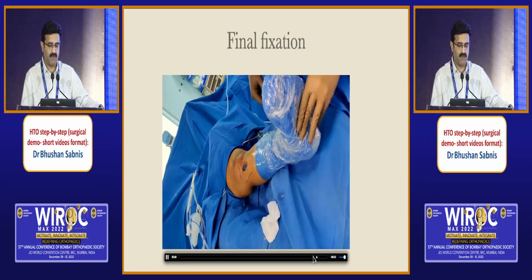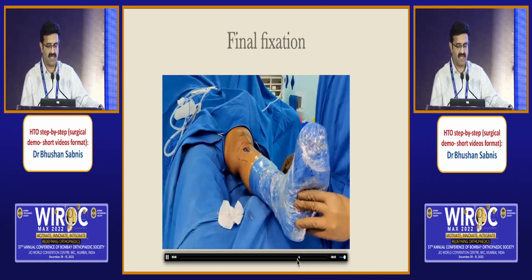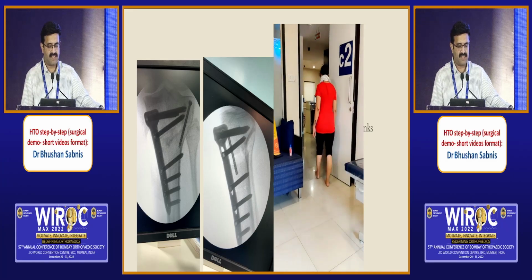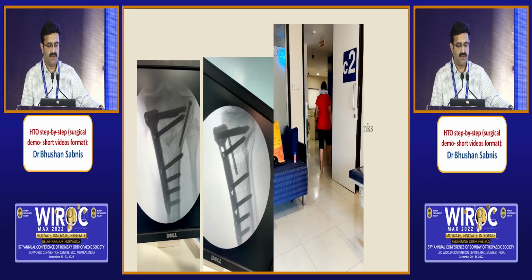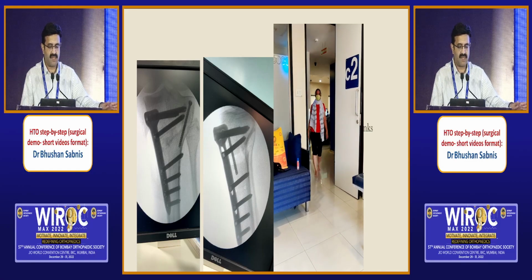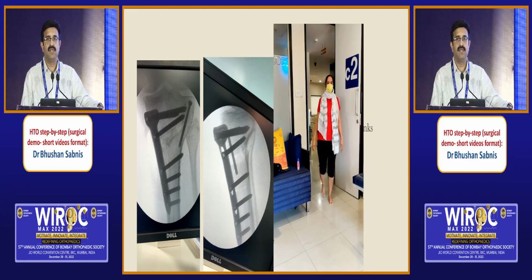And you can see the normal valgus alignment of the knee post osteotomy. That's the post-op X-ray, and that's the patient 6 weeks down the line, walking more or less comfortably without any issues as such. So that's roughly how you can do HTO in 7 minutes. Thank you.